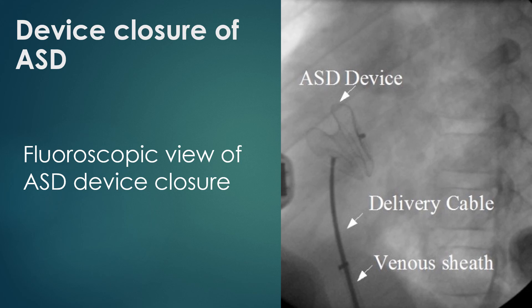This is the fluoroscopic image of an ASD device being delivered using a delivery cable introduced through femoral sheaths. Once the device reaches the left atrium, the left atrial disc is released first and brought into contact with the left atrial side of the ASD. When the position is ideal, the right atrial disc is allowed to form by withdrawal of the sheath. Once the two discs are in position with the waist across the ASD, slight wiggling is done to confirm secure fitting and no tendency for dislodgement.